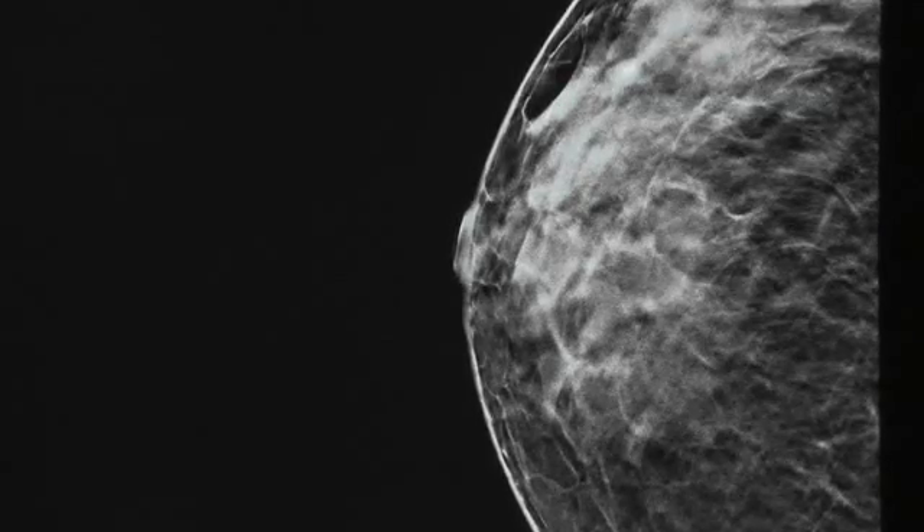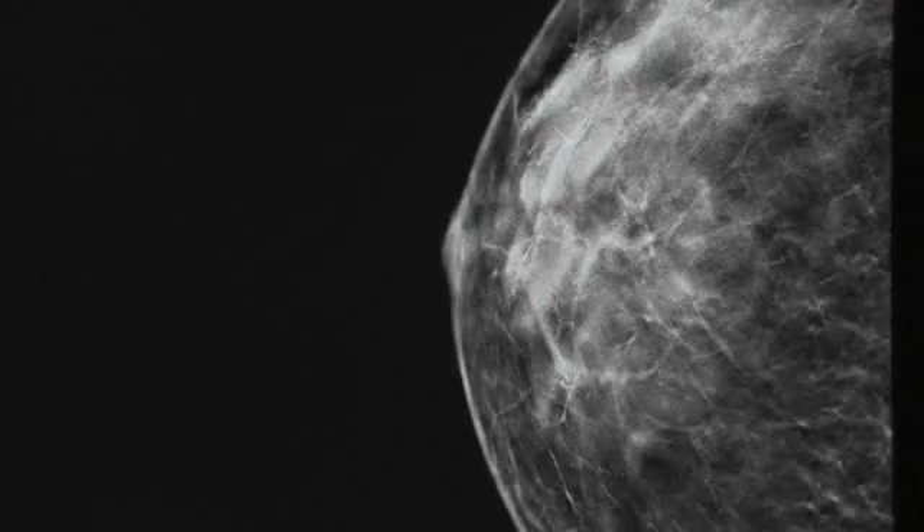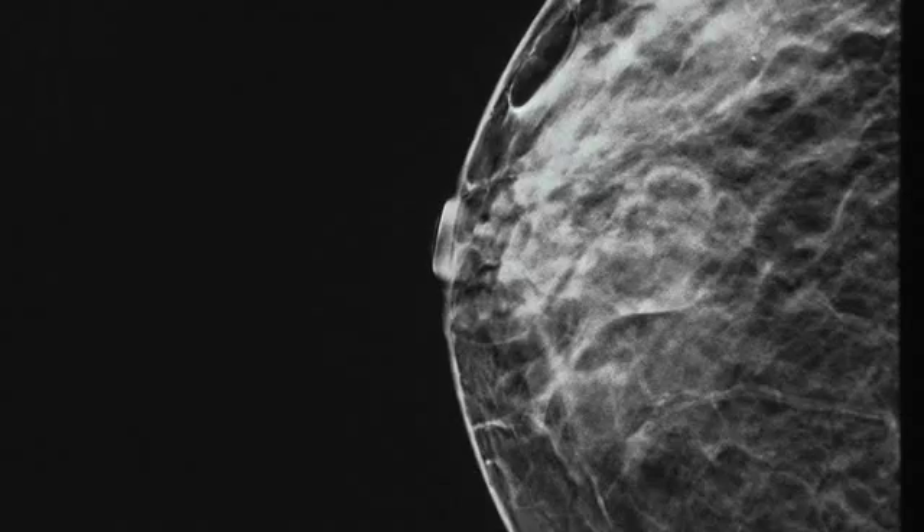Now instead of viewing all the tissues at a glance, the physician can move through the tissue layer by layer, clearly revealing details that might otherwise be obscured.